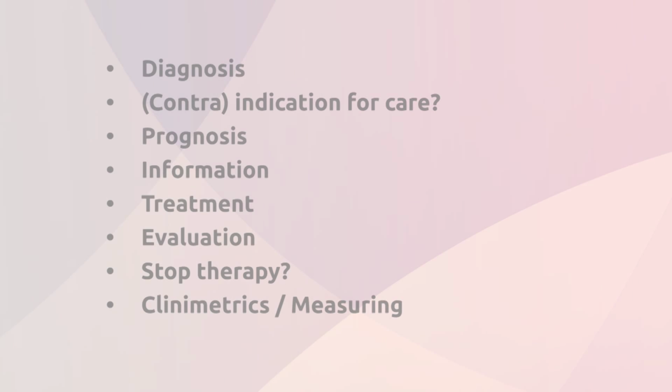Diagnostic MSU in podiatry is common in several countries. Some countries, however, have rules that prohibit this. These rules should be followed at all times. Still, diagnostic MSU in podiatry can be used for lots of reasons. I will explain a few of these as an example by using pathology images.